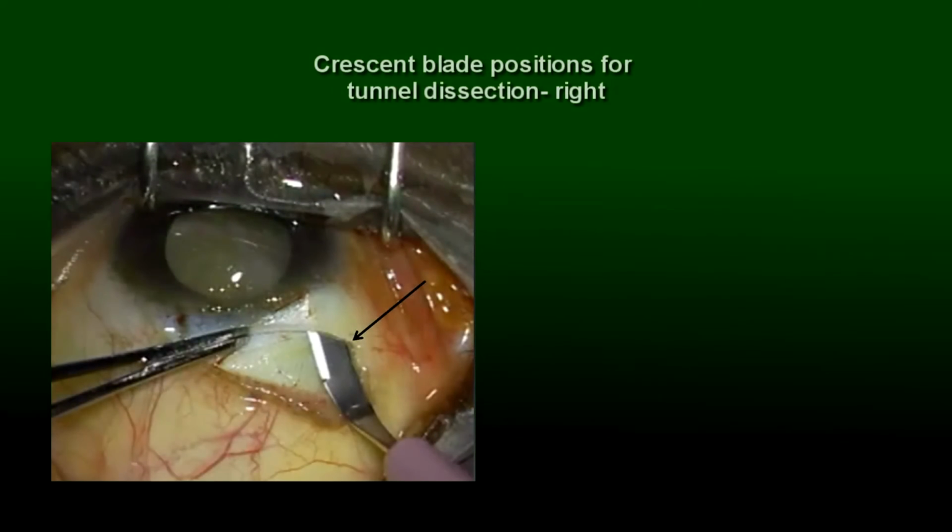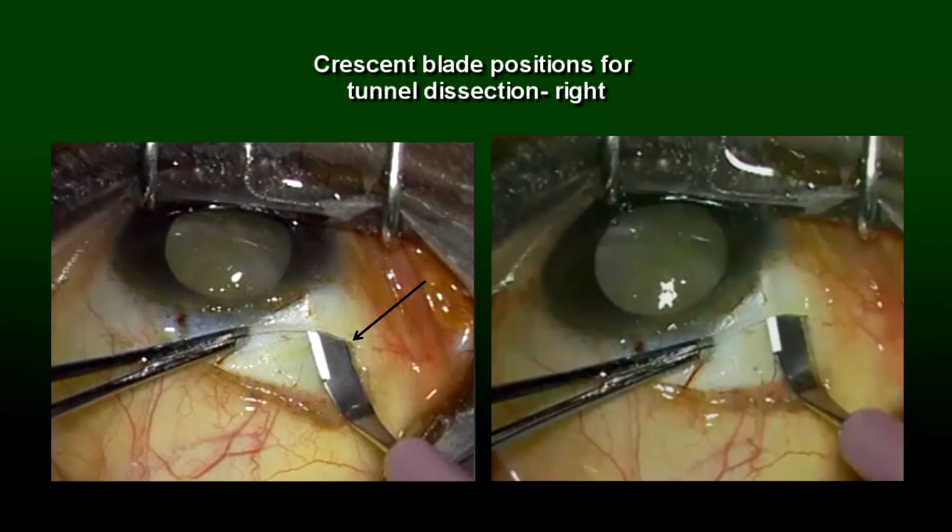Make sure you follow the scleral groove. So that's the end of the scleral groove right there. And you can see the blade, the heel is turned out to the side. The tip is angled towards the center. So it's not angled this way, it's angled this way. And I stop right there at that corner, and now I'm ready to complete this. This little corner of tissue is still uncut, but it's just that little corner that's left. And so it minimizes the force, like so. So now I can pivot it outward to finish it.